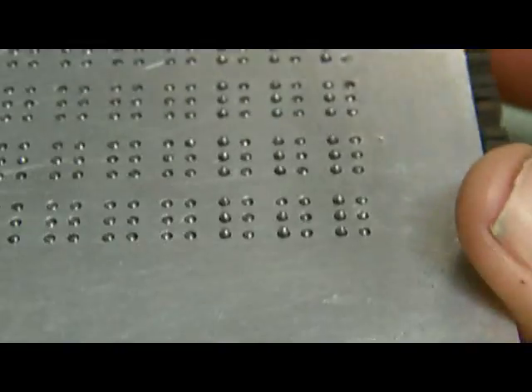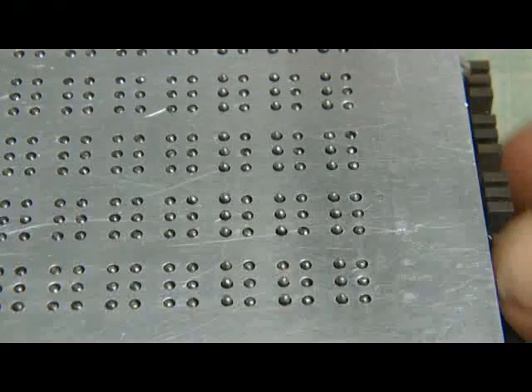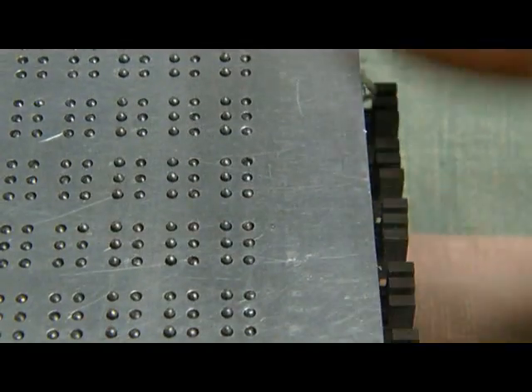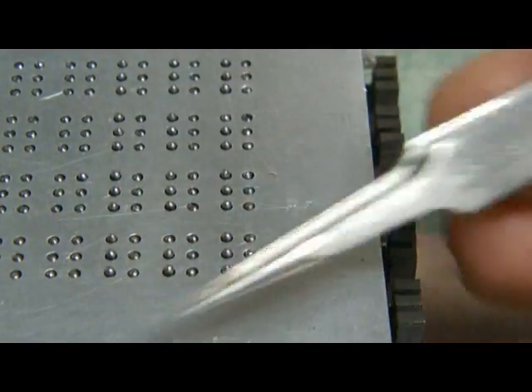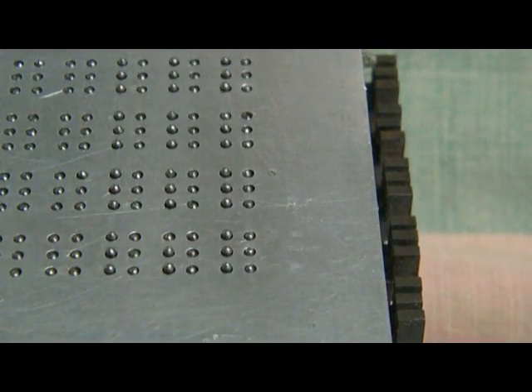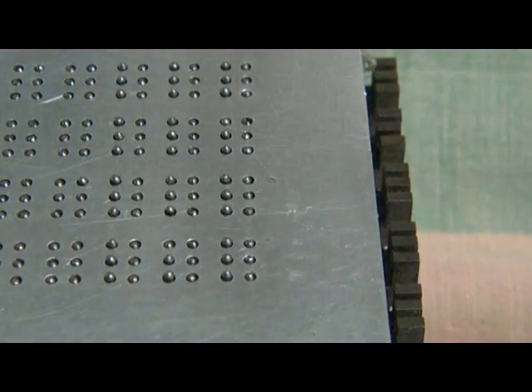You can see them, they dropped. So basically what I'm demonstrating is that you have the ability to latch any pin in any column, and actuate any pin in any column. Basically the column is set one column at a time. So the data word is in this case 5 lines of 3 rows each. That is the 15-bit data word. So you'd set a column of data at a time, that is a half cell at a time. Enable the column, set the data, and then latch the column again.